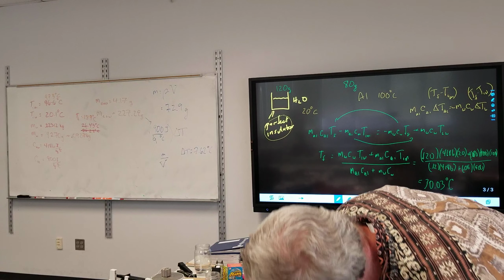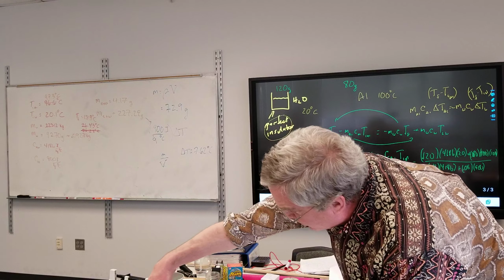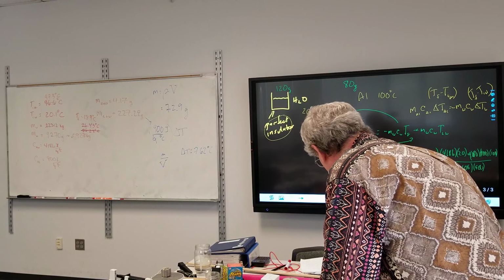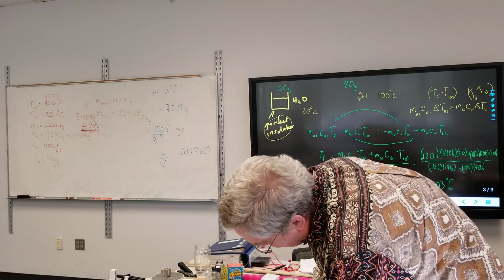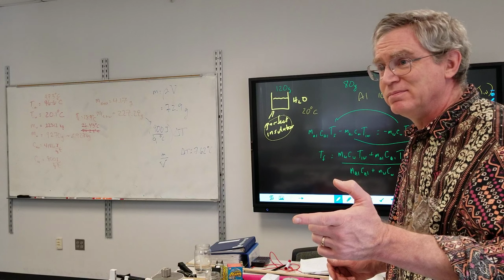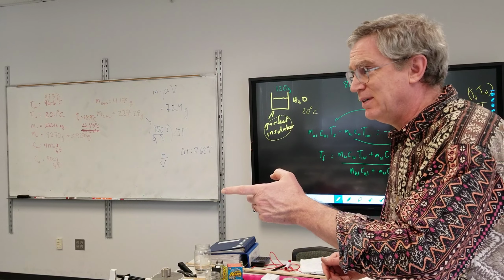All right, so the blue probe there, I'm going to go ahead and start this. Blue probe is this one right here. It's right now at the very top of this. Is that better? Worse? Same? Still same. And Michael, better? Yeah, it's just as good.